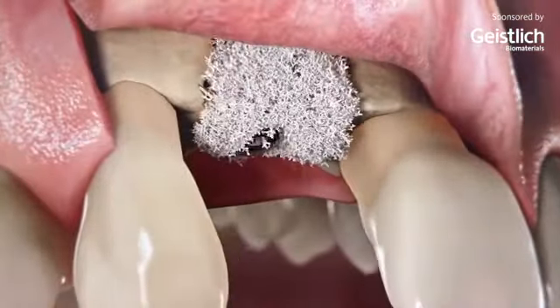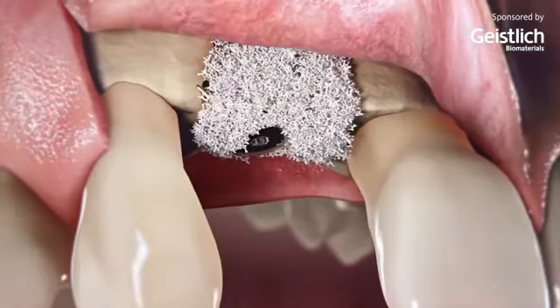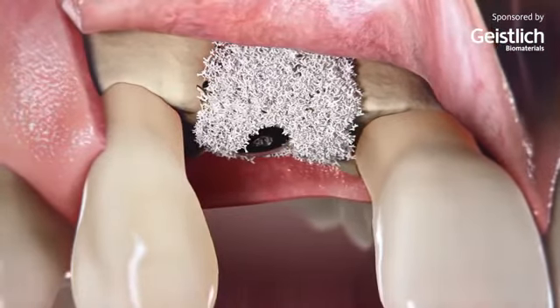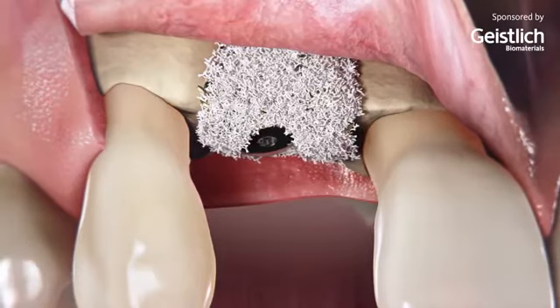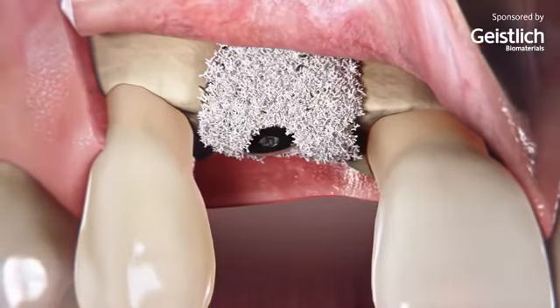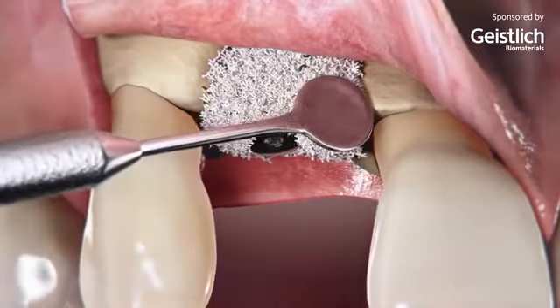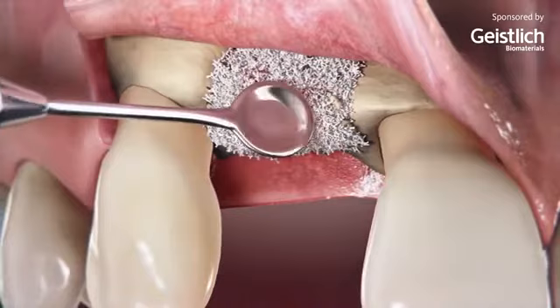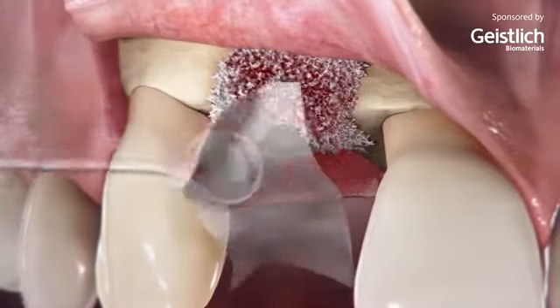The second layer of deproteinized bovine bone mineral particles helps to over-contour the ridge and provide long-term stability. This is achieved by the low substitution rate of the xenogeneic bone substitute.